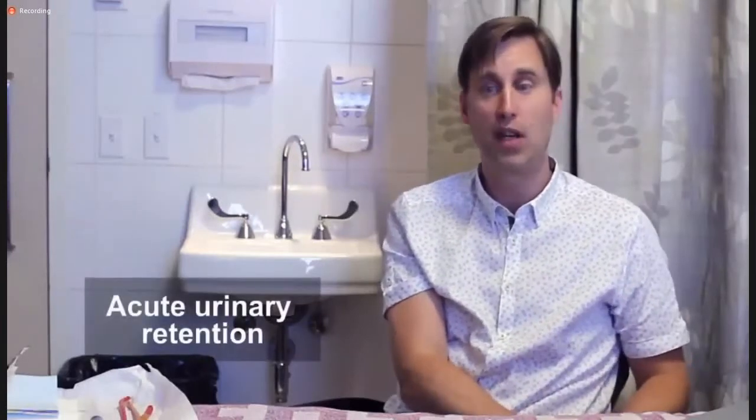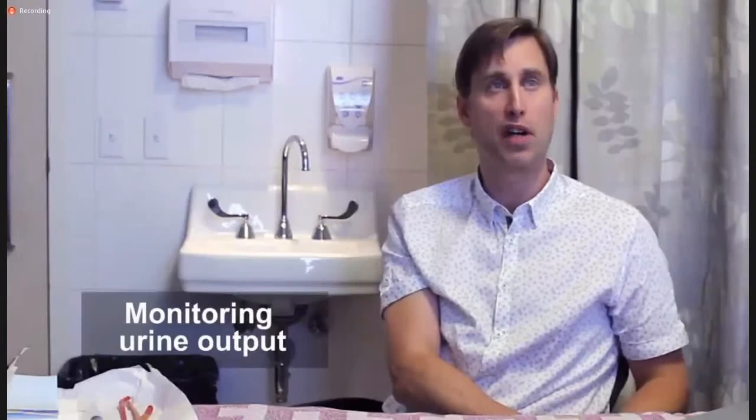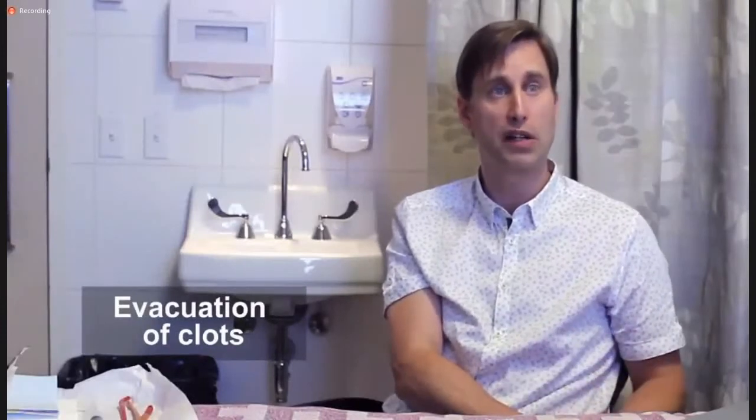Well, there's a couple of reasons, and one of the most common reasons is someone can't urinate at all, and we call that acute urinary retention. So in these instances, the patient's very uncomfortable, the bladder is full, and we place a catheter in order to empty the bladder efficiently. The other reason we put a catheter in is for people to have monitoring of their urine output. And that is usually closely associated with the degree of perfusion in their body. So measuring urine output can give you a very good idea of the status of someone's hydration and their overall volume status. The third reason that mostly we urologists put catheters in is for the purpose of evacuating clots and blood from the lower urinary tract.